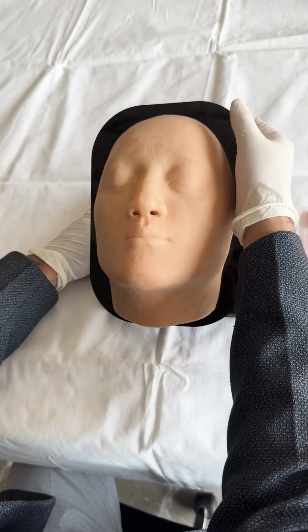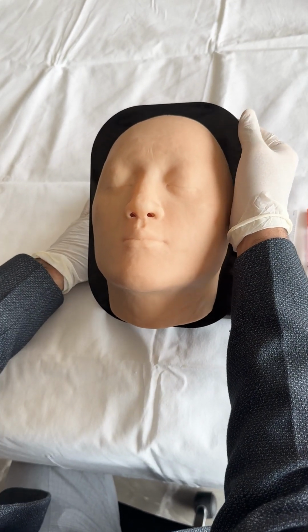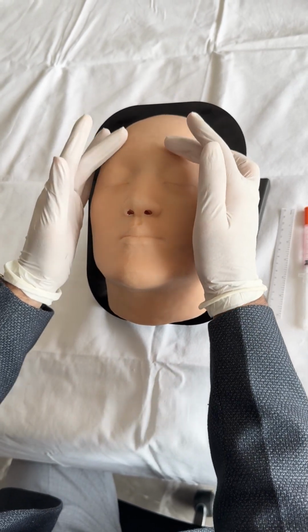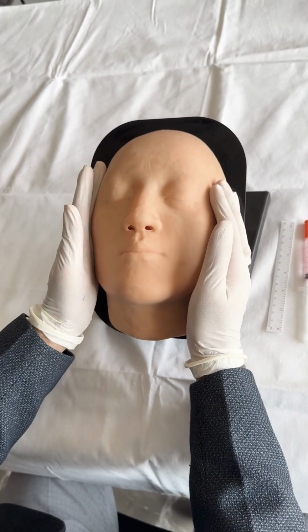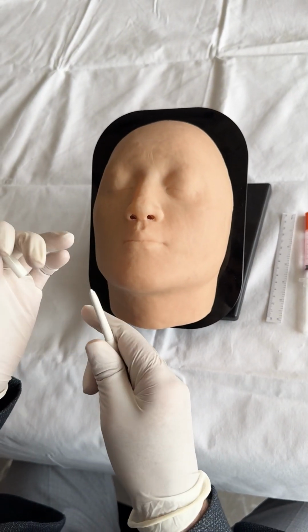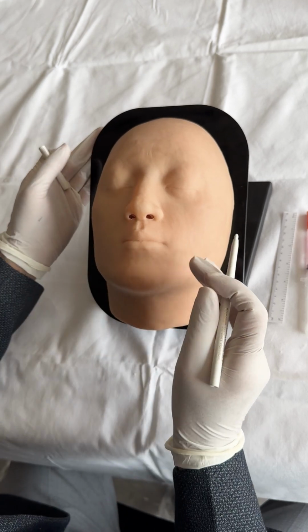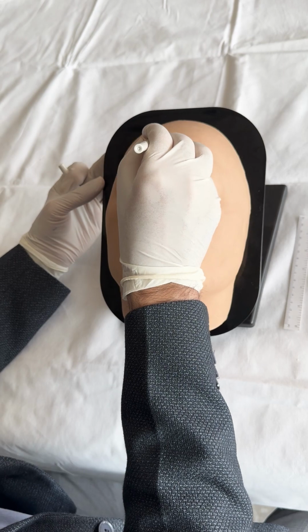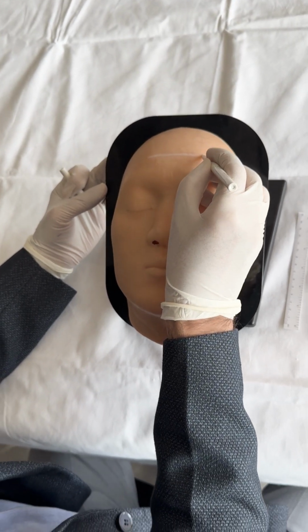Considering you are treating a real patient's face, analyze the injection points and start with the markings on the face where the botulinum toxin injections need to be performed. You can use any erasable skin marker and ensure you clean the face skin after the practice for the next training. The skin markers can be removed with water or an alcohol swab later.